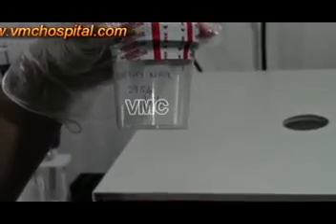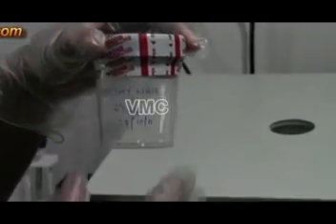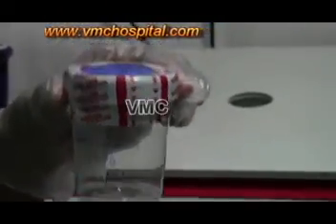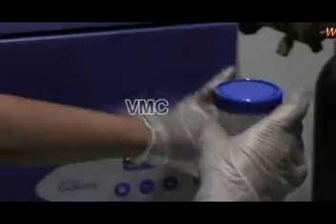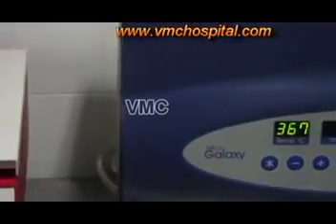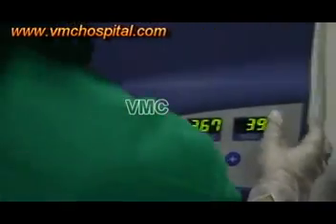The time of collection is noted and the sample is identified, and once the sample is kept and identified, it's kept for liquefaction in the incubator for up to 20 minutes or even up to 1 hour. Liquefaction is attained, that is, the sample from semi-fluid state changes to liquid state.